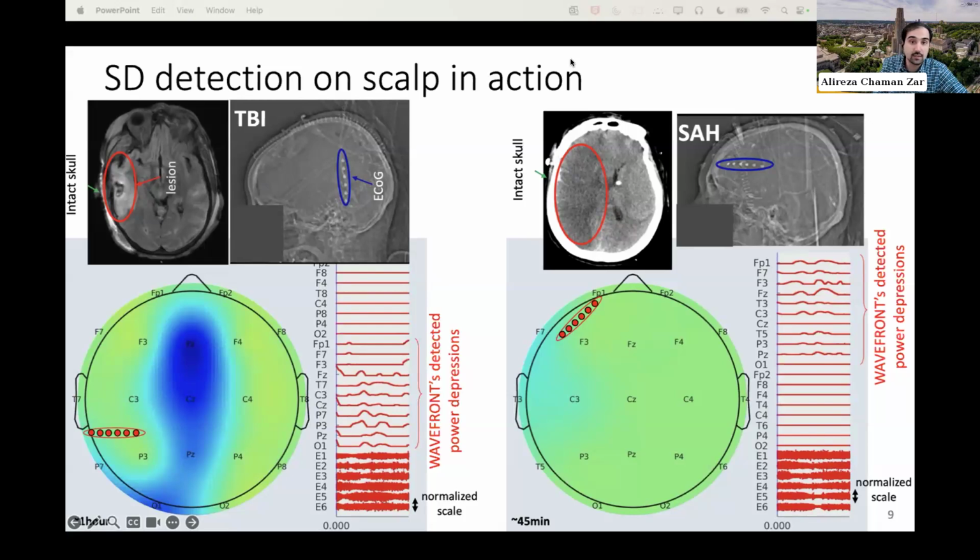So if we can have this wavefront as a way of early detection and prediction of worsening brain damage, then doctors can definitely use the available techniques that have been shown to be effective, at least on the research side. But these are 2 parallel efforts in the field, the detection part and the interventional techniques. Other techniques such as transcranial direct stimulation have been shown to be effective in animal models of SD, for example mice, but it's a work in progress. That's one. Very cool. Yeah, thanks.